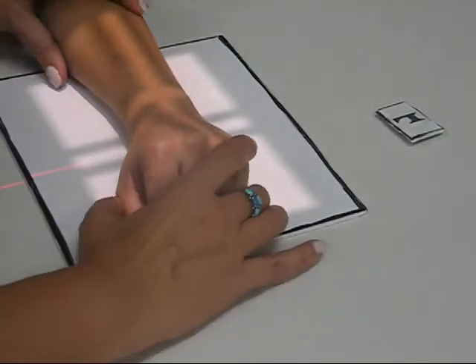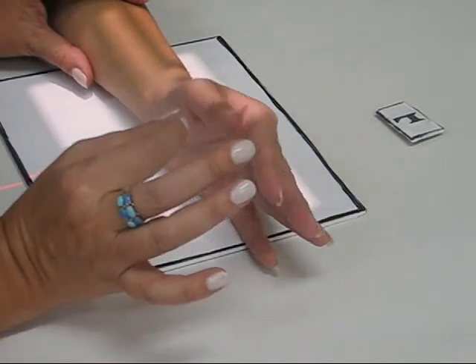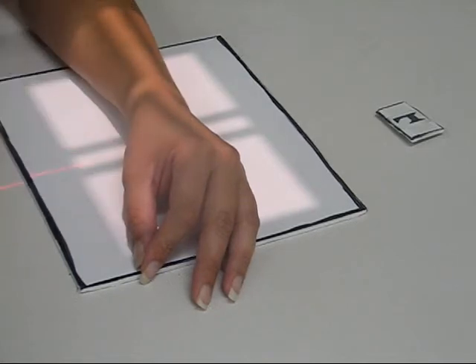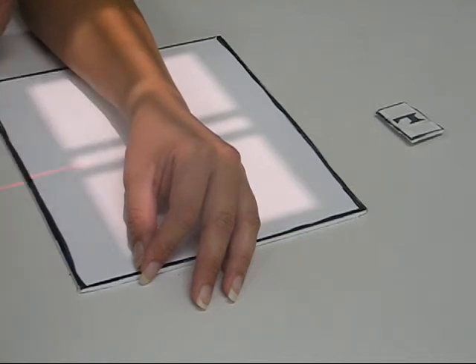So go ahead, open your hand, bring your fingers, touch these two fingers together, and let them fall on the cassette. Okay? You have a perfect oblique position of the wrist with a 45-degree angle to the image receptor.